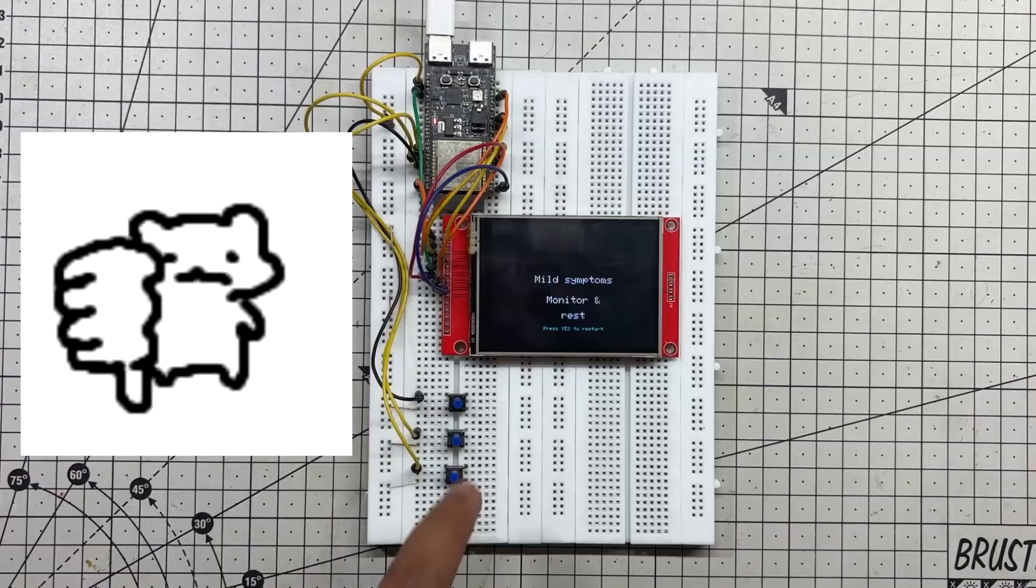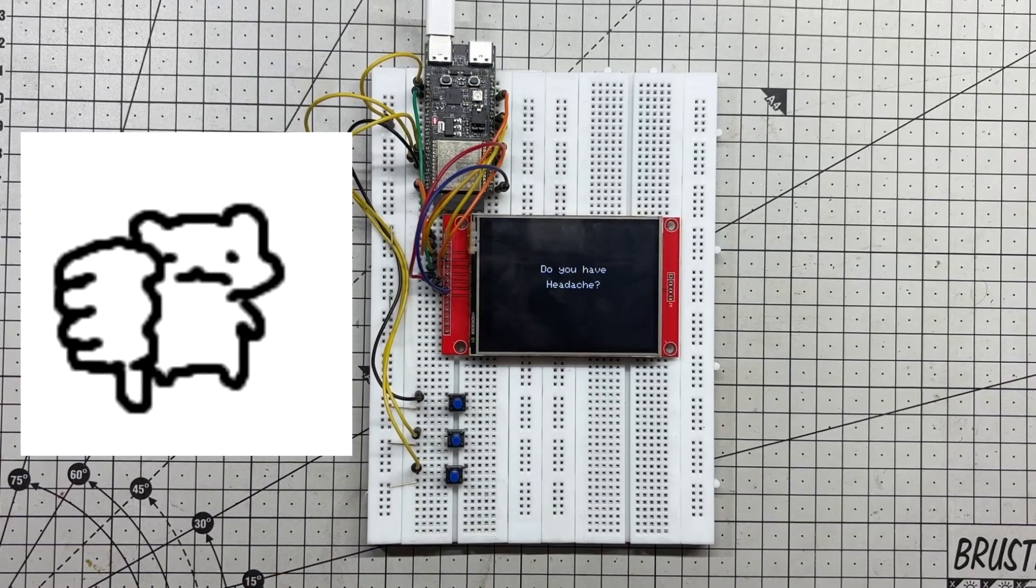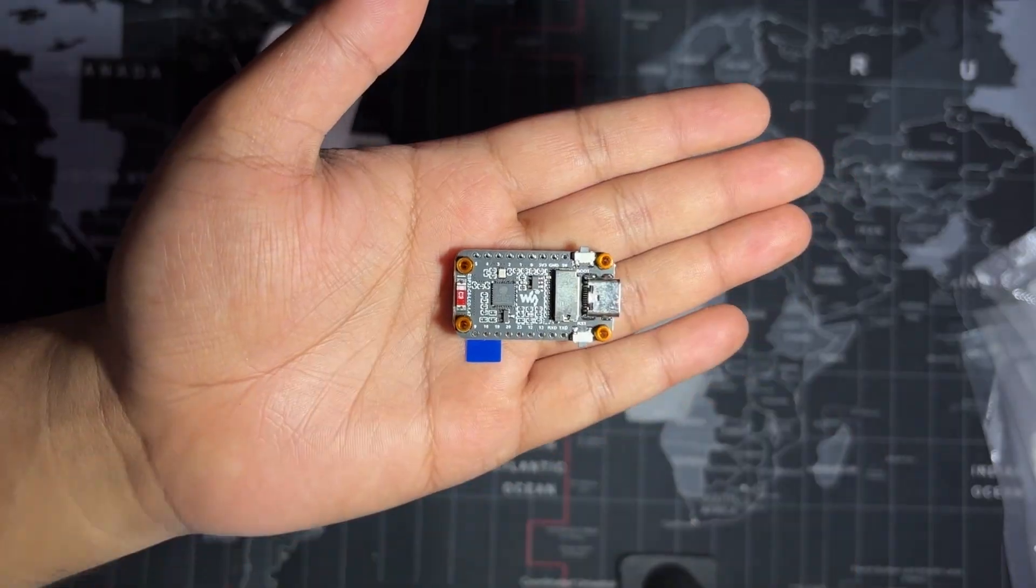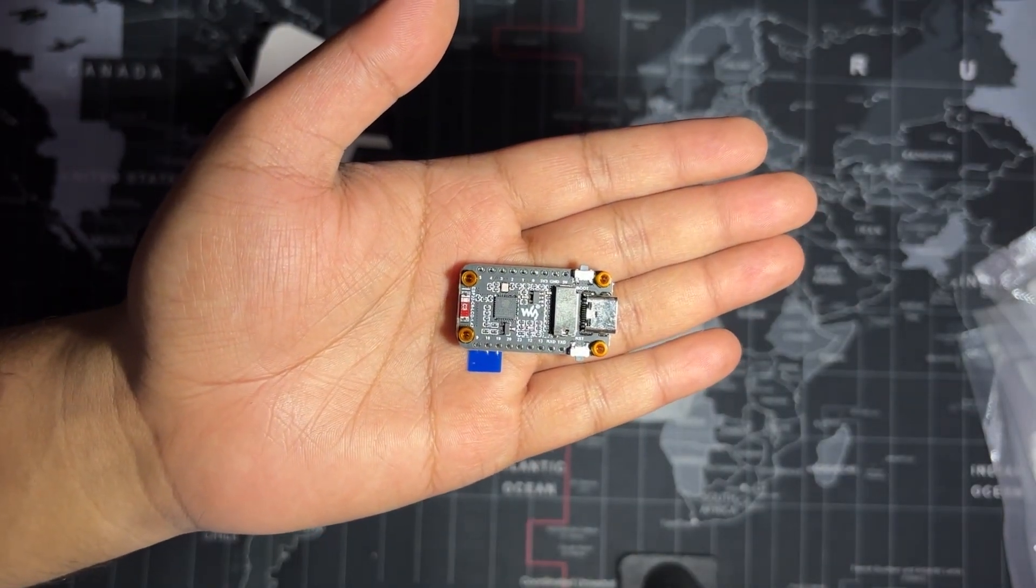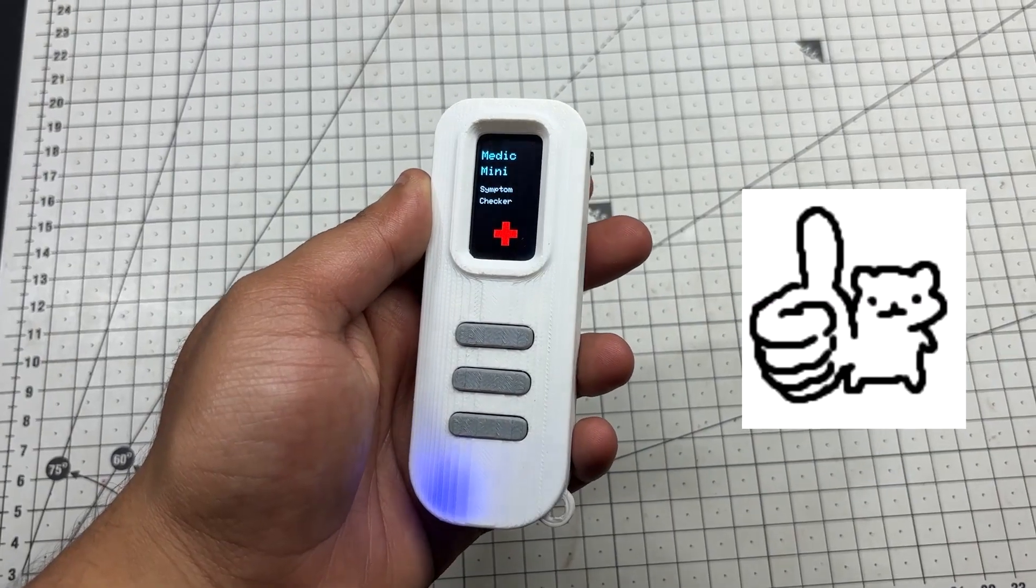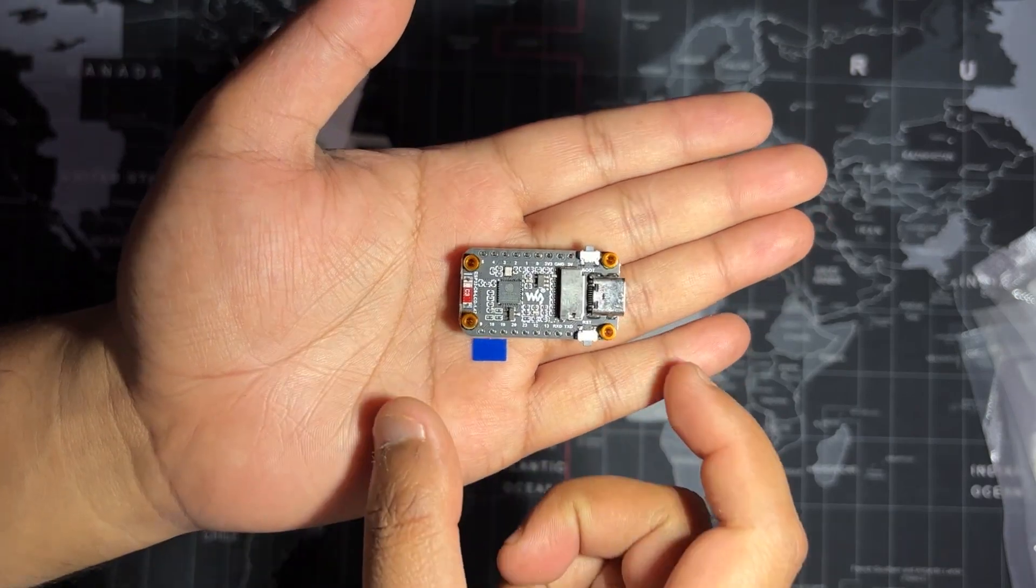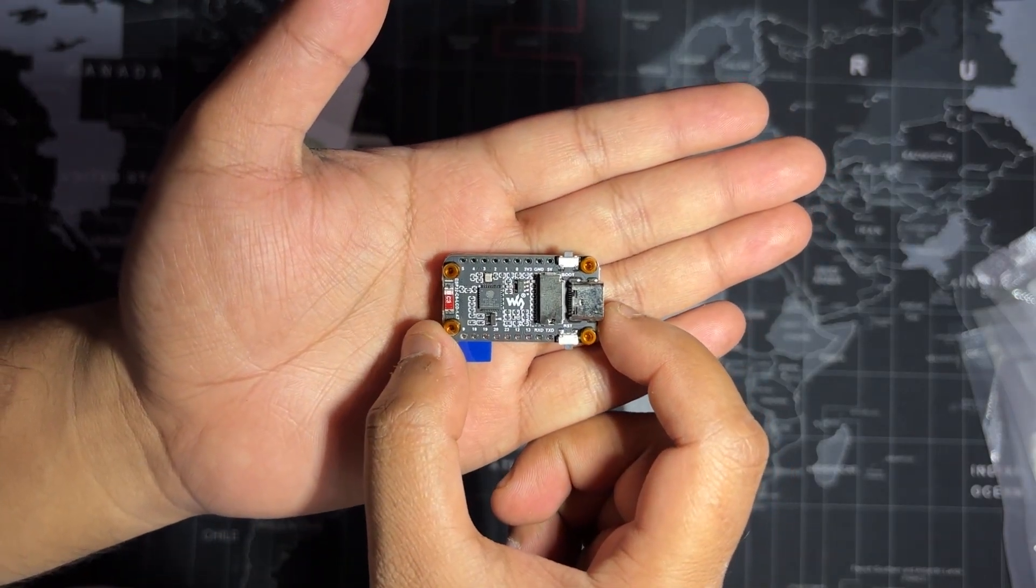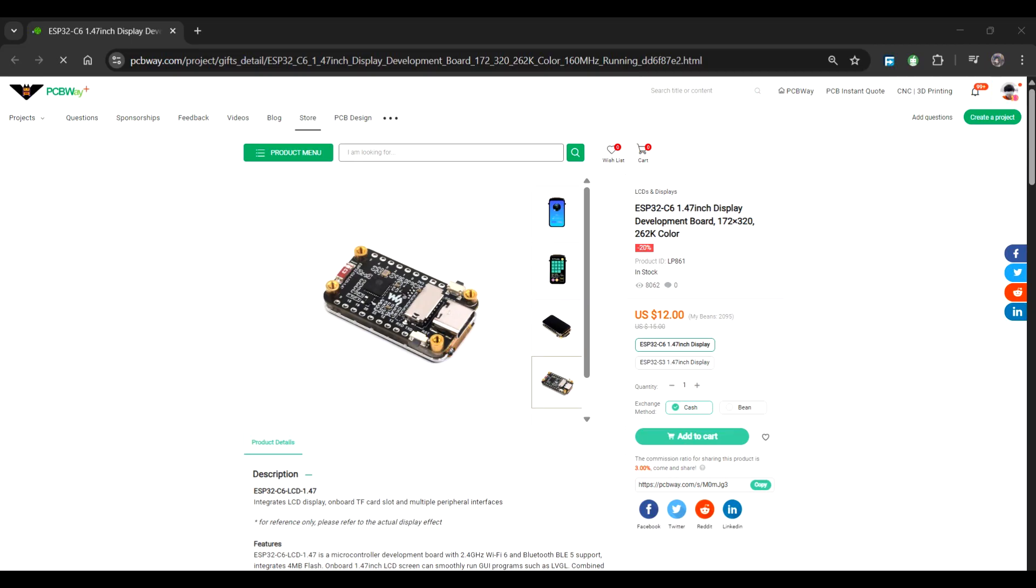This board let me ditch the breadboard and external display entirely. Everything is now packed in a single compact unit that fits inside a custom 3D printed enclosure. You can check more about this display from its wiki page. Also, for getting this display, I got it from PCBWay's gift shop.